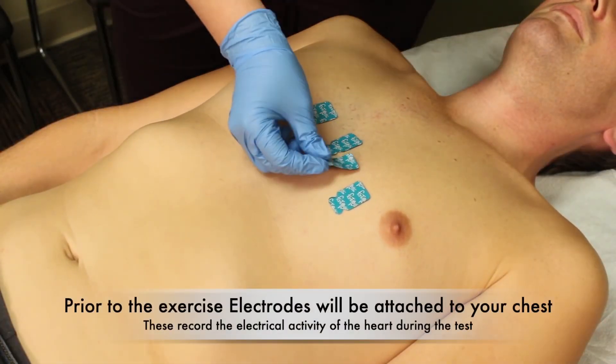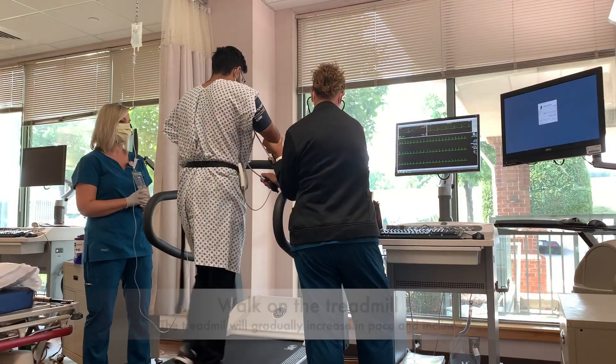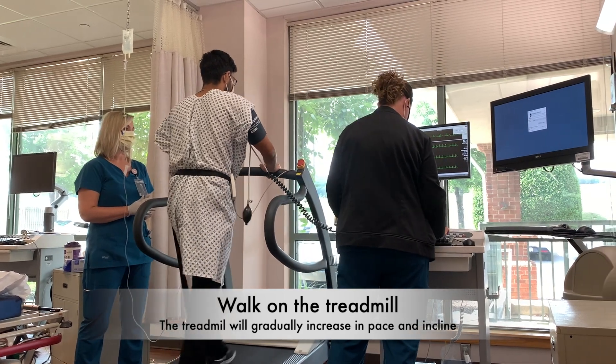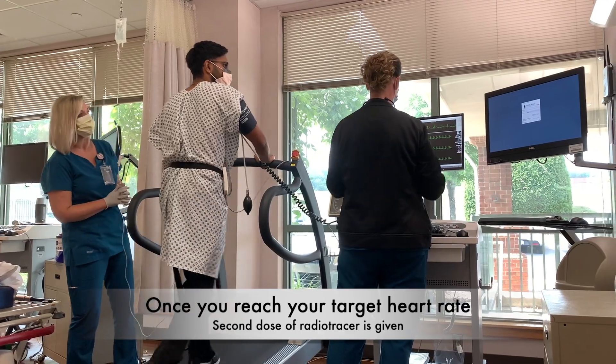During the test, you will have electrodes attached to your chest. You will then walk on a treadmill until you reach your target heart rate, and then you will receive another injection of radioactive tracer.